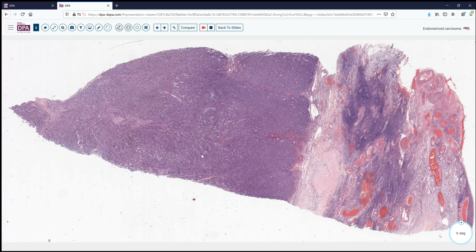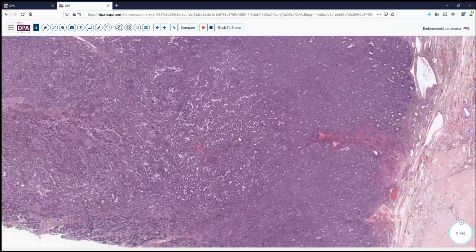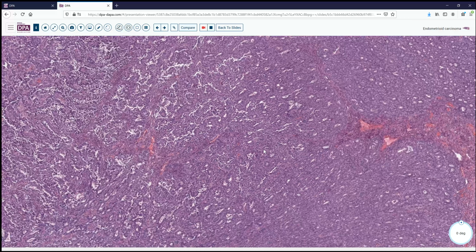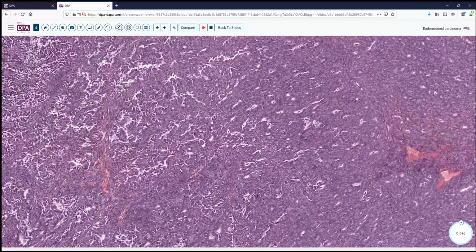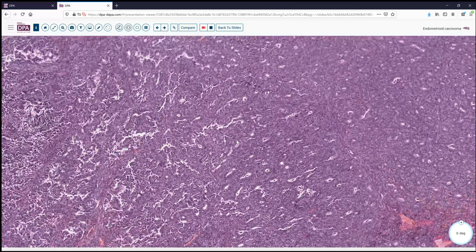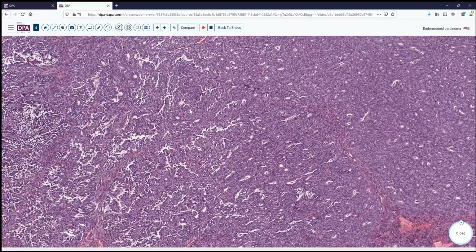Now, another ovarian tumor, we can see here's ovarian parenchyma over here, corpora albicans. This is not a difficult case. This is clearly mostly solid tumor with epithelium, and we could debate and question whether the classification of this tumor as serous or endometrioid is appropriate. But we can see that there's a nice glandular component to it as well as solid growth. So this would fit nicely into the grade 2 or 3 endometrioid carcinomas that can arise in the ovary.